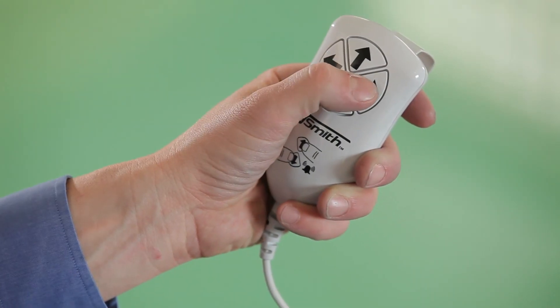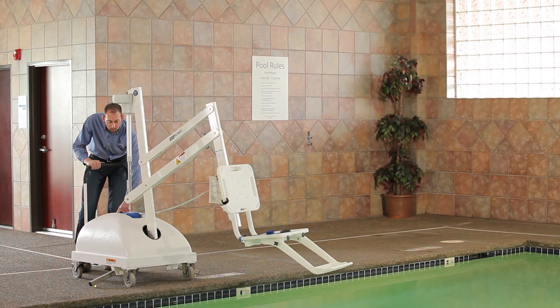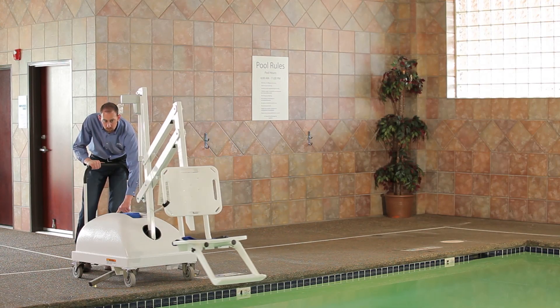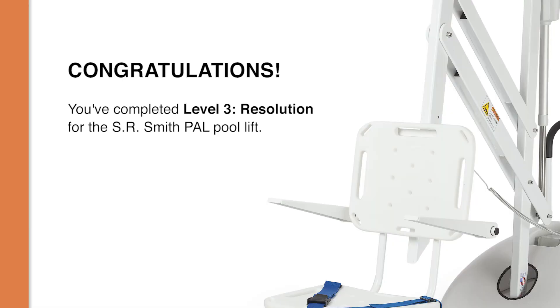Make sure to test the lift functions after replacing either the motor assembly, motor cable, tension spring, or gears, using both the touchpad control and the hand control to confirm that the lift is functioning properly after installing any new parts. Congratulations, you've now completed the final video in the PAL troubleshooting series.